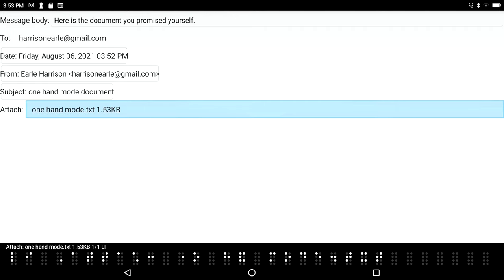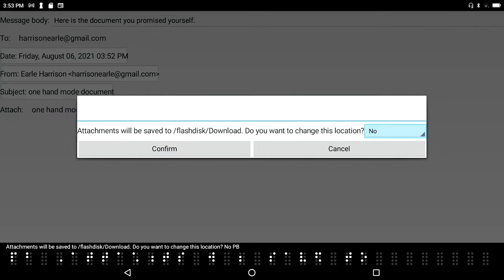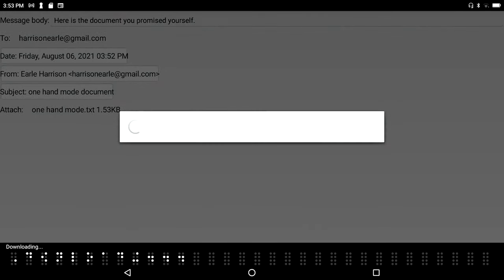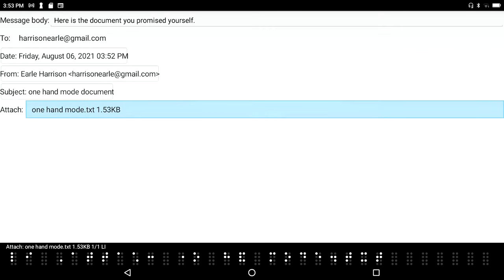If I press enter on it, it says attachments will be saved to flash disk download. Do you want to change this location? It says the attachment will be saved to flash disk download, that's the file path. Do I want to change it? I could, but I don't think I want to, so I'll just press enter. Downloading. Done, one file saved.